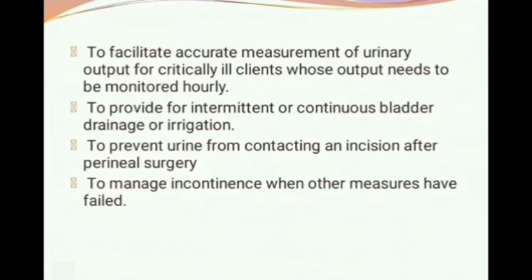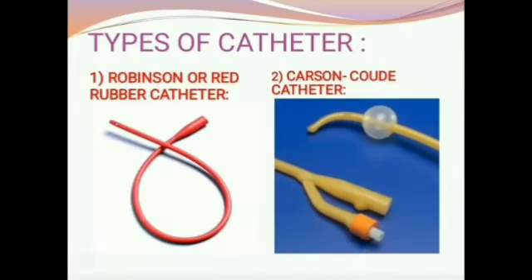to provide for intermittent or continuous bladder drainage or irrigation; to prevent urine from contacting an incision after perineal surgery; to manage incontinence when other measures have failed.